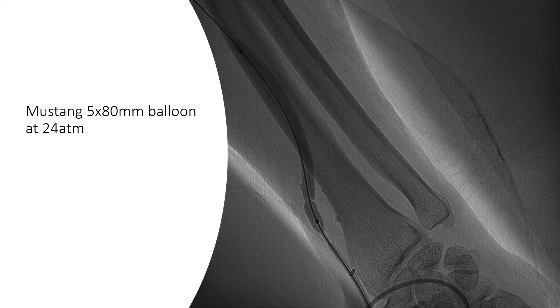We were able to then come back to the vein and do further pre-dilation. We tried a 5 mm Mustang balloon at 24 atmospheres, which still left a residual constriction, which you can see here quite clearly.